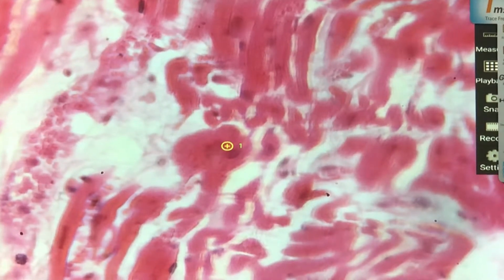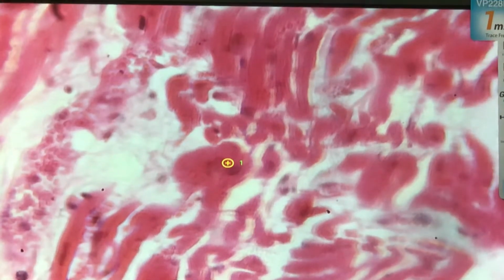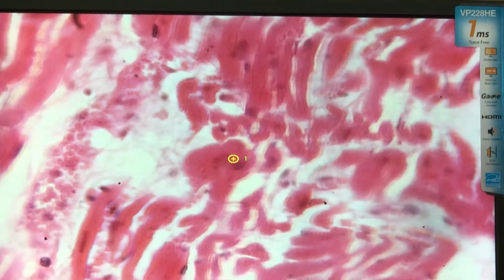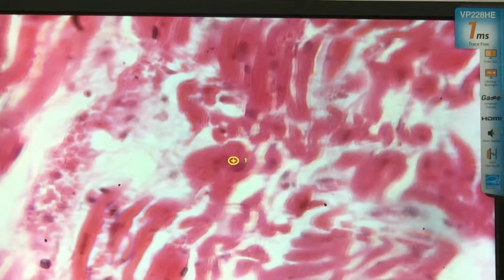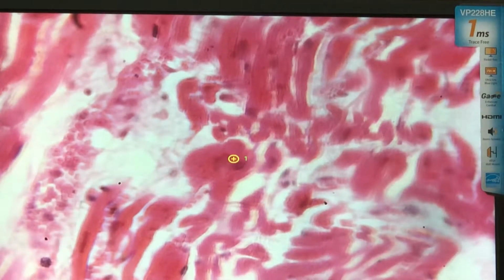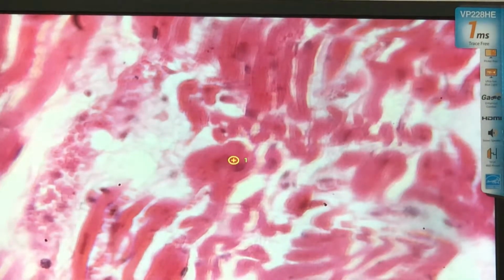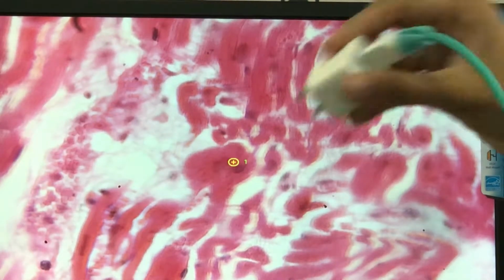So take note of this, because when we go to cardiomyopathy, we'll have a slight difference, and that will confuse you in the practical exam. The picture for hypertensive heart disease is a large nucleus. These are red myocardial tissue, like that. But the nucleus, you have to judge the nucleus. The nucleus is very tremendously enlarged.